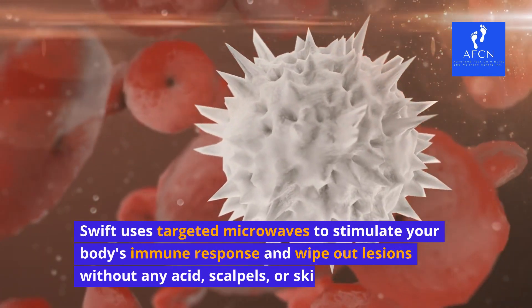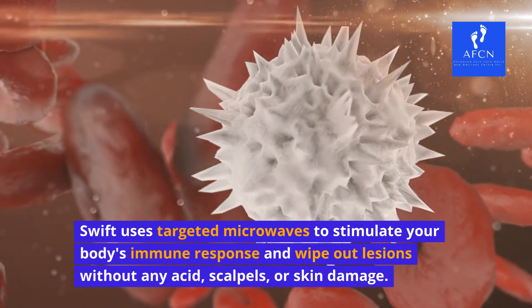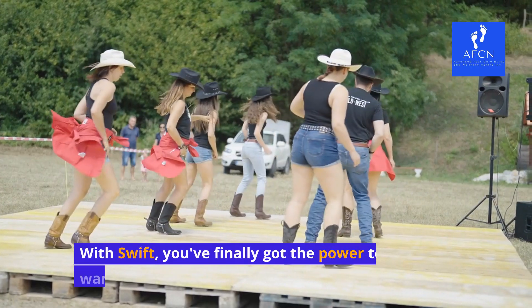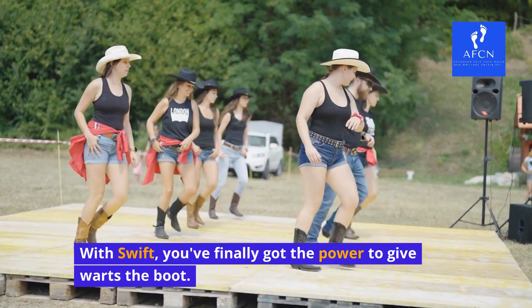Swift uses targeted microwaves to stimulate your body's immune response and wipe out lesions without any acid, scalpels, or skin damage. With Swift, you've finally got the power to give warts the boot.